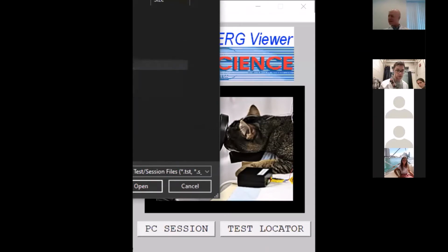let's see if I can share a bigger screen. Is that possible? I'm noticing that not everything is showing up on the screen. Let me just grab some data.